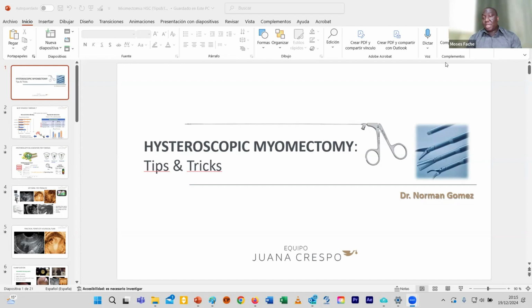a step forward. I must comment that the instruments are expensive. I have a TrueClear Elite, and the disposable seal is 250,000 naira. It's a disposable, single-use seal of that TrueClear Plus that he uses. So if you're going to do this kind of procedure, then you should also be ready to invest a lot in good equipment, because those 3mm tools would not go in through the regular hysteroscope that we are used to. So I think that's just my comment.